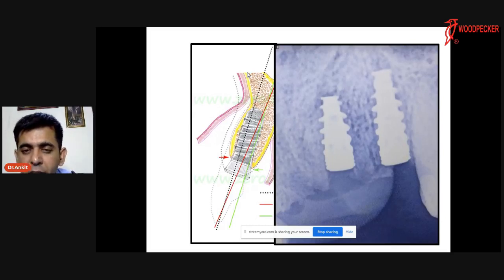The most important thing that we need to consider in our implantology practice is that the cortical plates of the residual ridge should be carefully split, maintaining periosteum attachment at all levels on the buccal side, that is in the apical third, the middle third, or the crestal third. Because if we maintain attached periosteum, it is very critical to the formation of new bone around the interproximal surface of the implant, that is peri-implant osteogenesis. It becomes very predictable, considering the ecosystem is there, and it is very helpful for implant bone formation to occur, right?